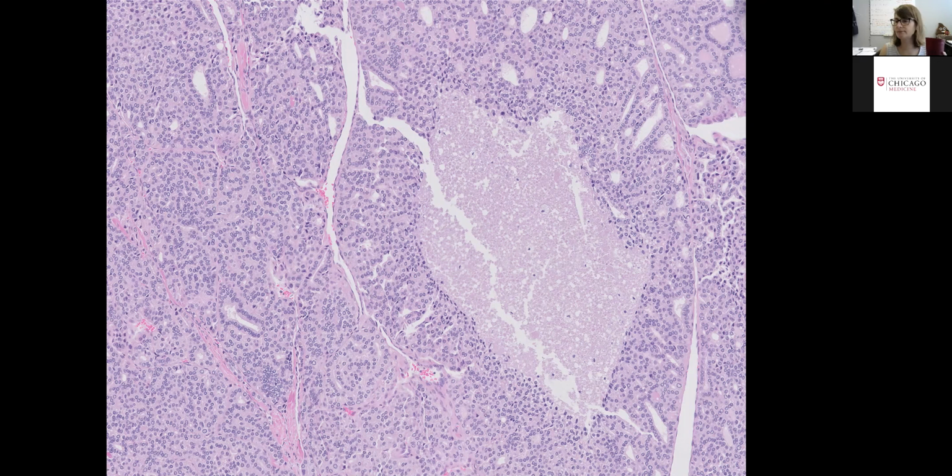Please write something. Thank you. Necrosis, comedo-necrosis, exactly. So this is necrosis in a thyroid. Never, ever good, okay? So you have solid growth, you have necrosis, you have mitoses, okay?